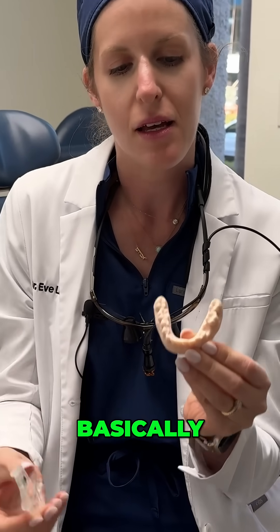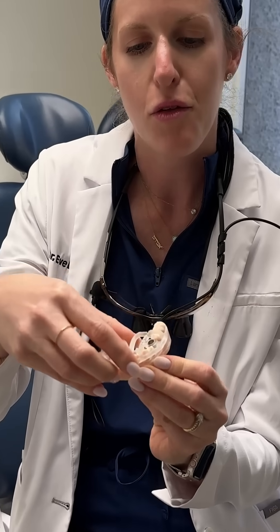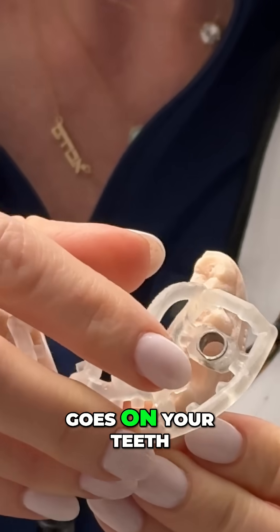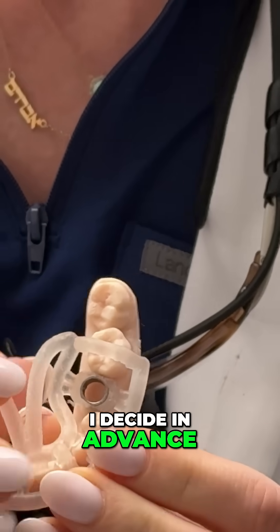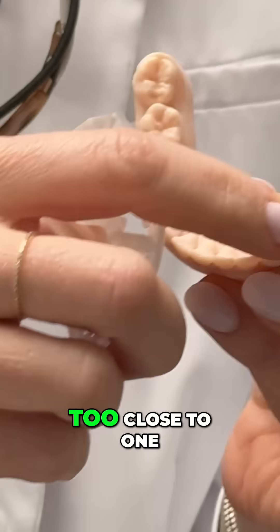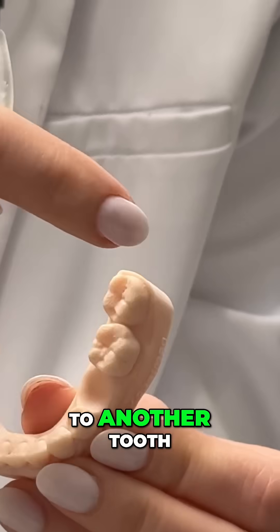Basically it allows me to place the implant simply through a hole. This piece of plastic goes on your teeth. I decide in advance digitally where I want your implant to go, so that it's not too close to one tooth or too close to another tooth.